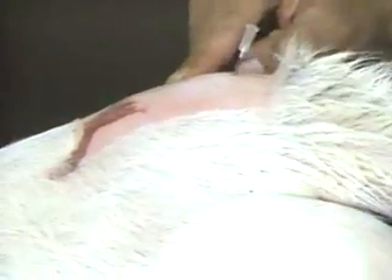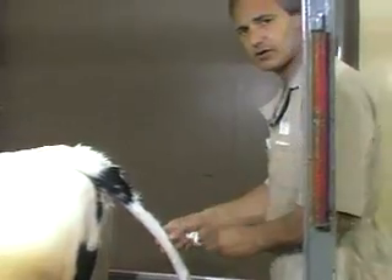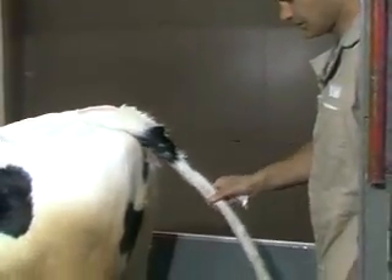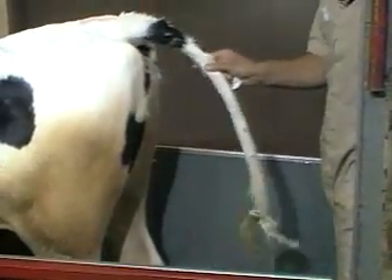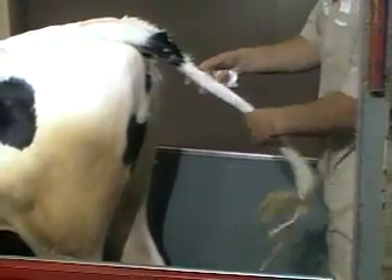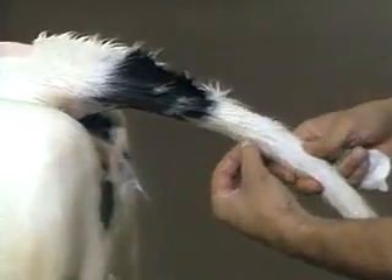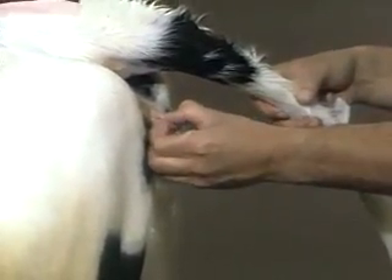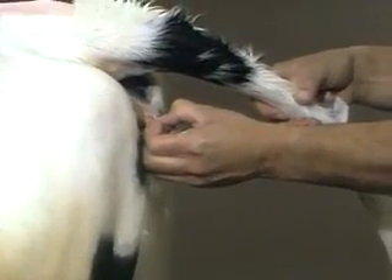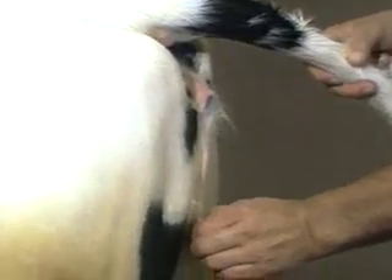The test for successful epidural anesthesia is to grasp the tail, shake it back and forth, and check for laxity. This cow has no control of her tail — she's just totally limp. Not only that, she has no sensation of pain upon pinching. Even if you get to a sensitive area like the vulva, pinching as hard as you want raises no sensation. And then you can test the loss of sensation all the way down her rear parts as well.